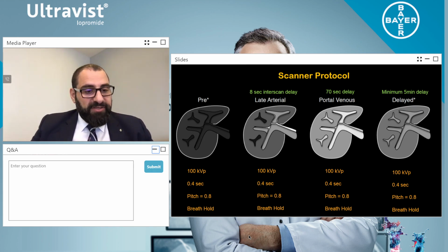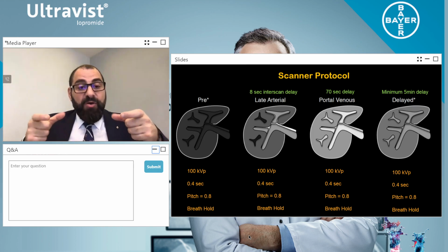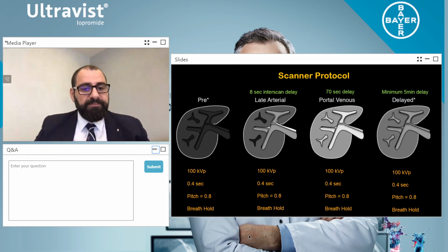Now we have another customer, Wayutri Nuguru. Thank you so much for your question. It says, are you using a dual flow injection technique or partial on your injector? Which is better? Another amazing question. So I use 2 barrels. I inject my contrast and I have my saline to follow. When I talk about dual flow, this is another important area, okay? And now I use this mostly dual flow in my vascular and my chest oncology applications, which we'll talk about in 3 weeks or 4 weeks' time.